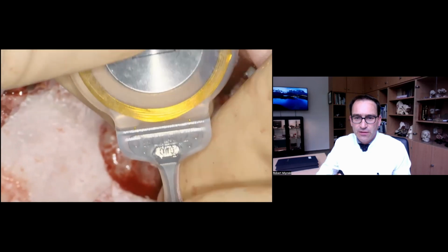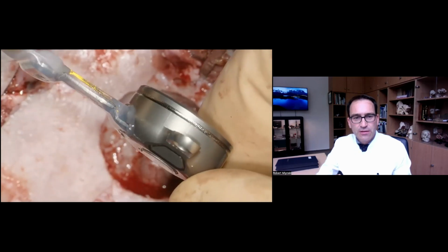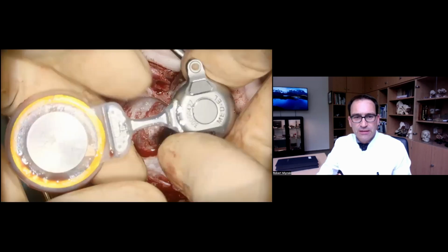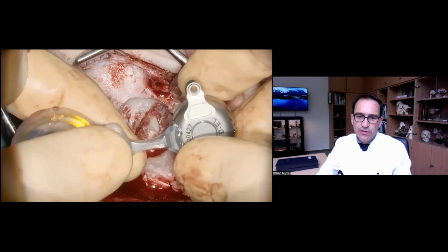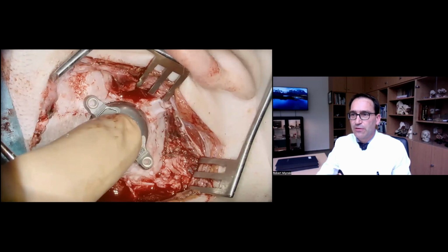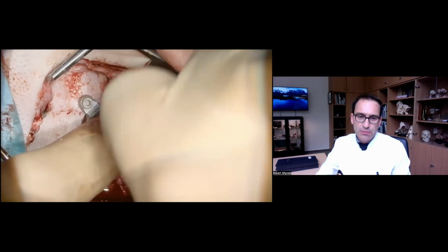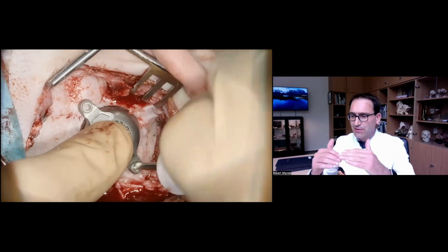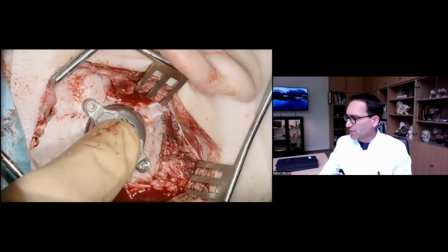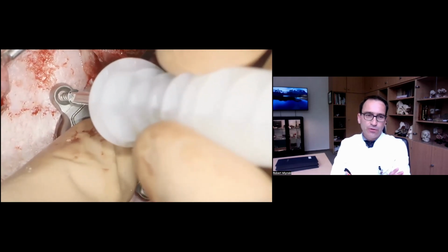And here is the intersect or transition to the coil, which can be bent in order to have a convenient placement of the implant. What is convenient? It is if the implant stays parallel to the skull and has no bulking and is not rocking at all. Especially rocking of the coil is not advisable, because if it rocks, you have movements. Movements cause bleeding, cause what? Cause fluid around the implant, and fluid around the implant can always cause infection.